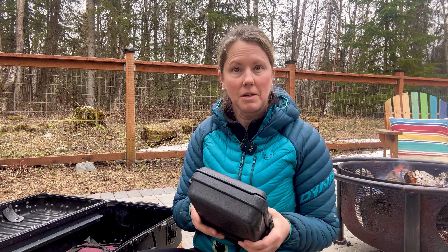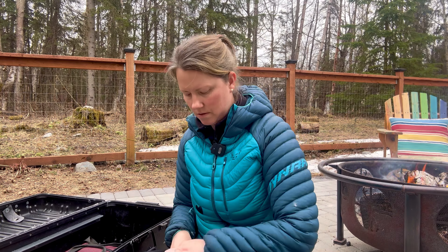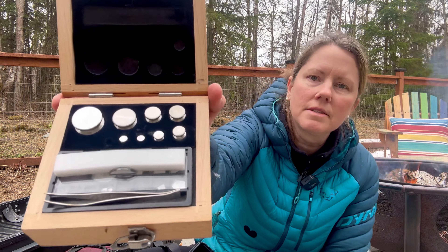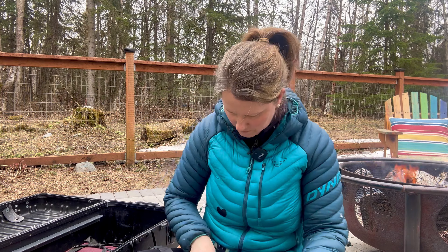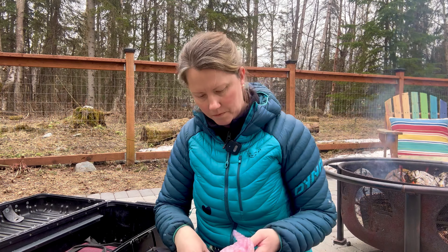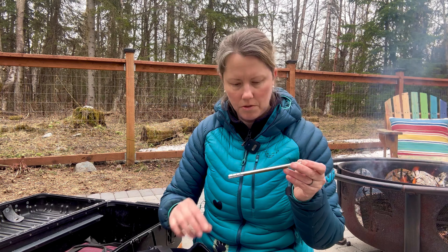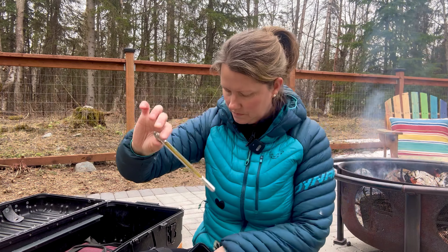This box holds multiple things. I have little weights for testing baby scales, another thermometer tester, and a holding thermometer that I use for testing sterilizers out in the clinics.